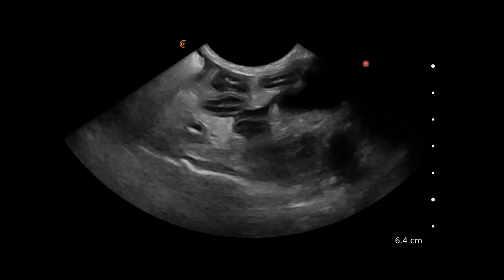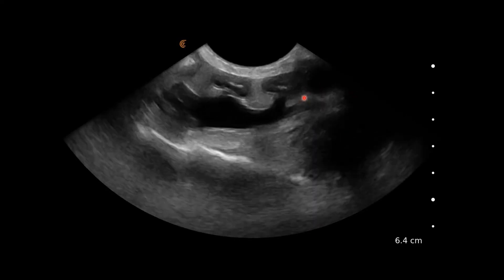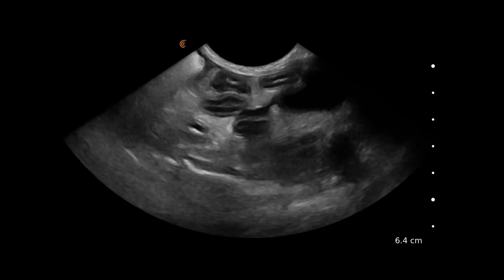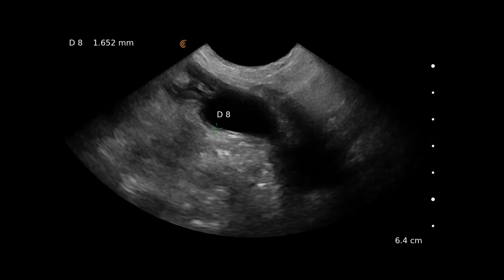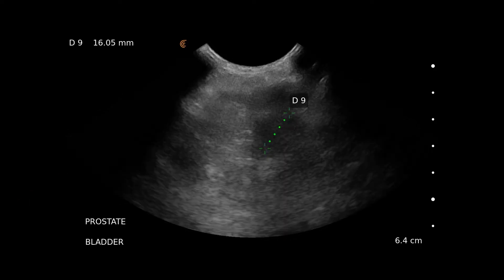We also have the bladder here in the caudal image. A closer view shows the bladder is fairly empty and small, but the bladder wall is still very thin. Scanning caudally to the prostate, it's not very obvious in this neutered male.